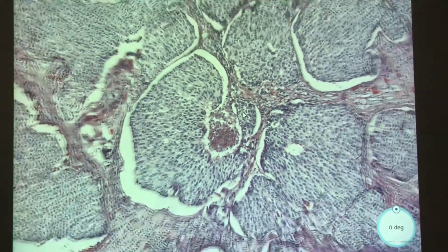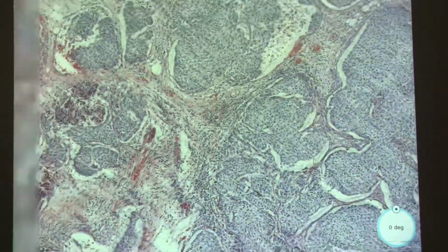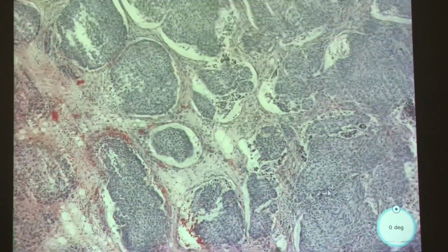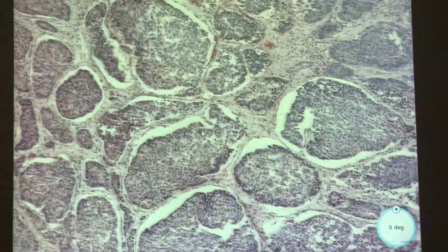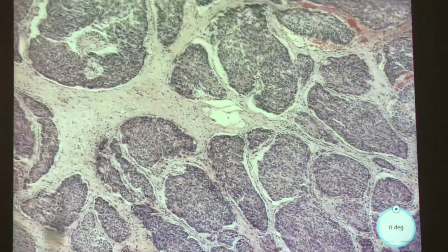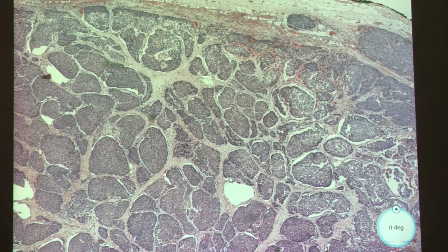And it's TIS. Question: when wouldn't we call it TIS? Well, if it's invasive, right? Exactly. If you saw foci that were obvious invasion, then you'd be like, we're not going to call this TIS. But yes, that is the general recommendation, that you call these TIS, same as you would for DCIS.